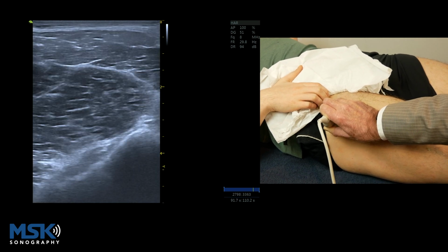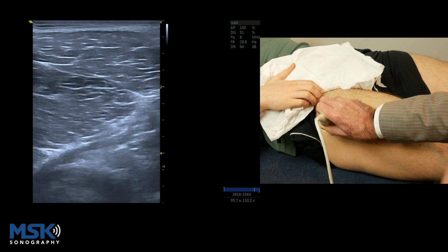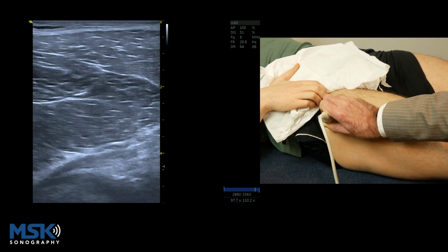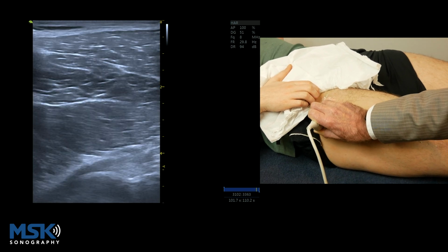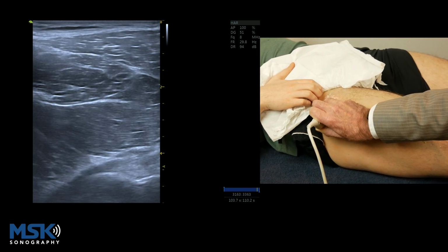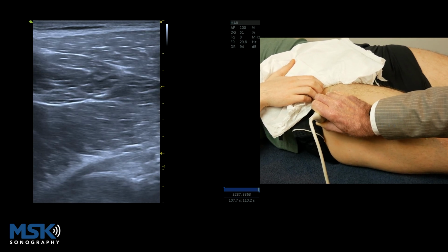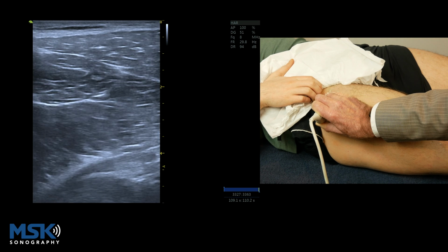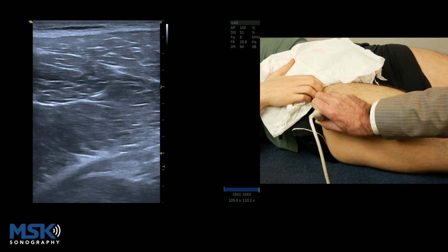And if we go distal, we're onto the femur, and if we go proximal, we come right through that distal aspect of the tendon attachment. It's better there, it's more of a fibrillar shape there, so we're now starting to get more perpendicular.